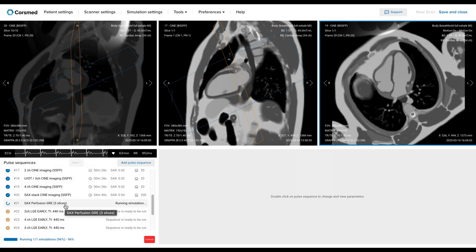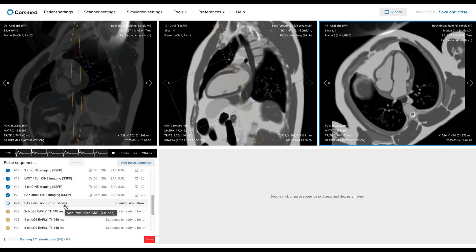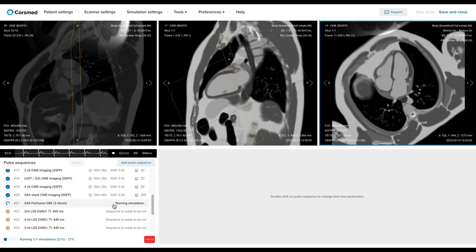In real life, we will first acquire 8 or 10 baseline images before any contrast arrives. Then we hit the injector and capture another 45 to 50 phases as the contrast washes through. And if the heart is really struggling, we add more phases.